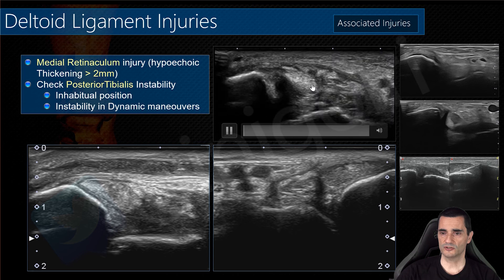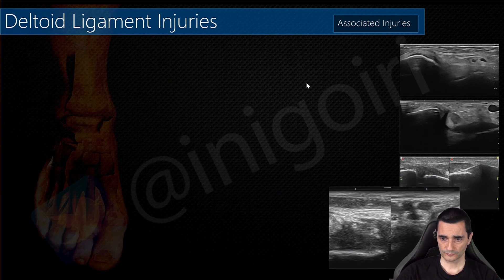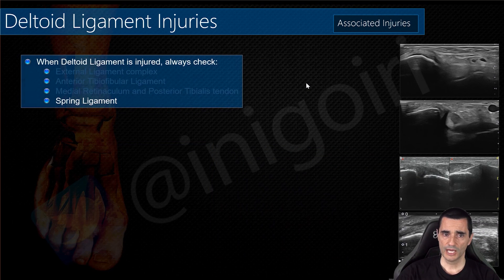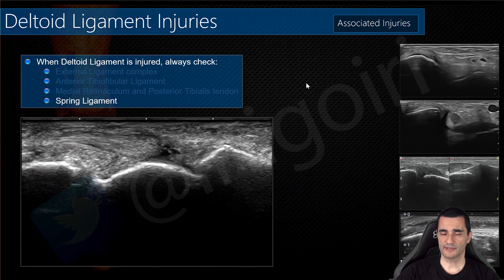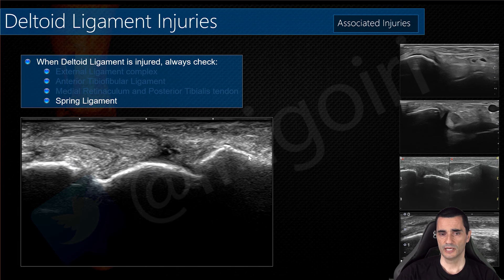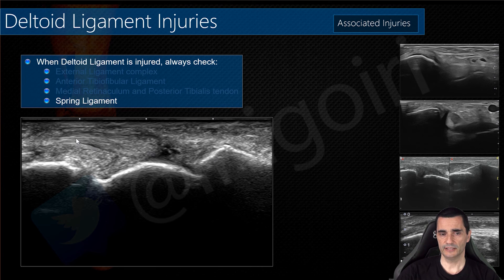This is the affection of the retinaculum. To finish, the spring ligament: this is the sustentaculum tali, this is the head of the talus, and this is the navicular bone. Between these three bones the spring ligament should be located, but you can see the posterior tibialis tendon is inside where the spring ligament should be — specifically inside the superomedial fascicle.